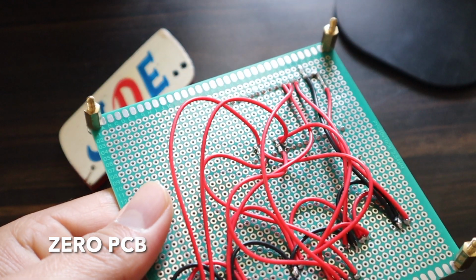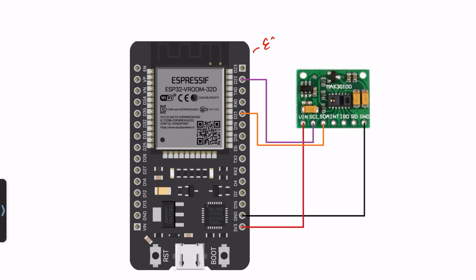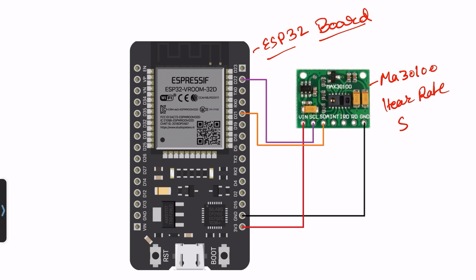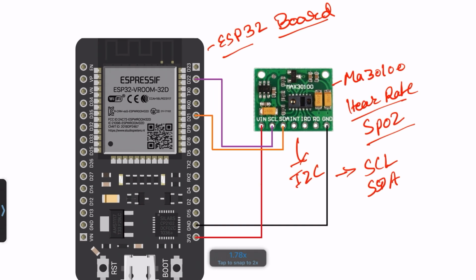Let's see this circuit diagram. In this circuit diagram, I use this ESP32 microcontroller board, and I use this MAX30100 sensor, which measures heart rate and SpO2 level and is used in the medical field. It works on the I2C protocol. I2C works with only 4 wires: SCL pin, SDA pin, VCC and ground.